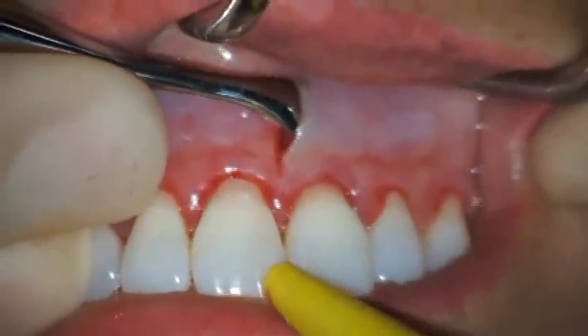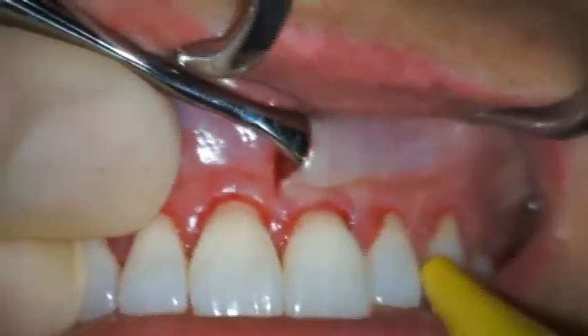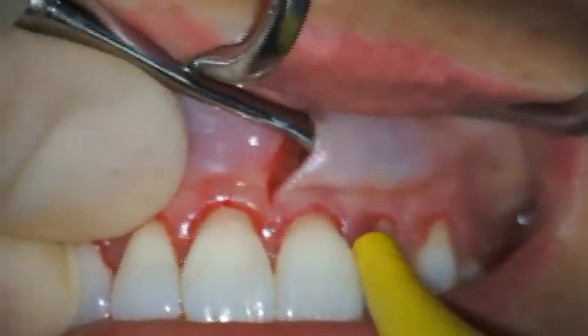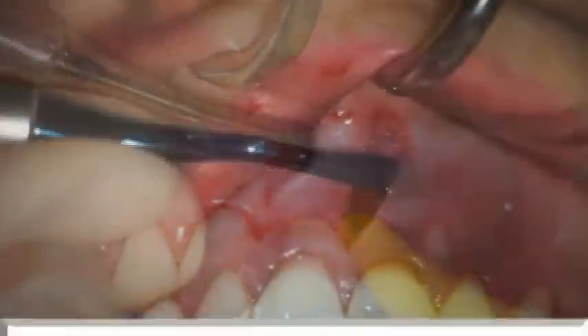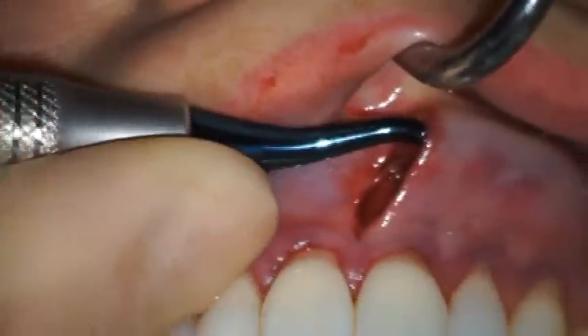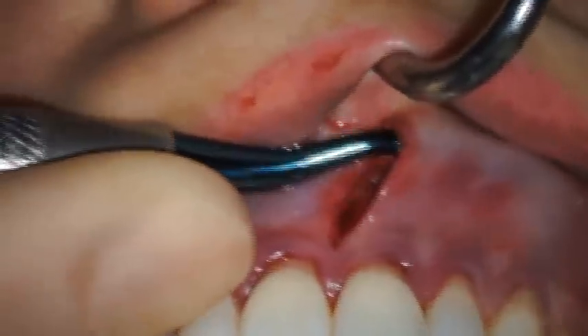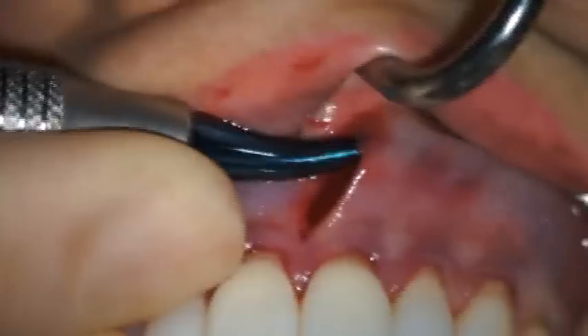Beginning with a straight-shanked VISTA-1 periosteal elevator, a bilateral subperiosteal tunnel is prepared, extending just beyond the most distally treated teeth. To facilitate access to more distal areas of the tunnel, a VISTA-2 elevator with a more curved shank is used. In order to avoid soft tissue perforation, the elevator must remain against bone at all times. The tunnel is extended beyond the mucogingival margin.